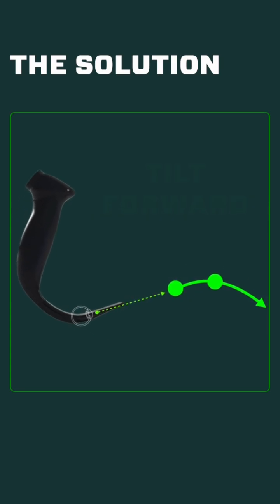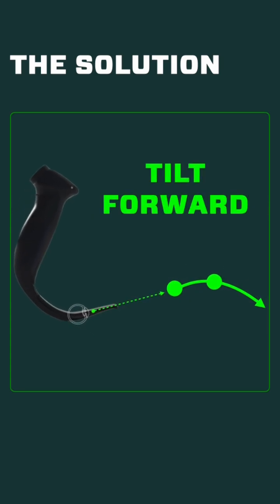Finally, just tilting that handle forward instead of pulling it back. The inclination is to rotate back to try to get a better view, but with a hyper-angulated blade, tilting that handle forward away from you is going to help align your axis with the trachea even better, and that's going to smooth out tube delivery even more.